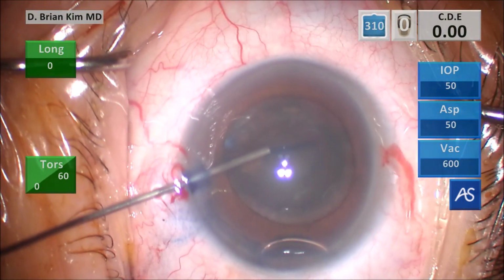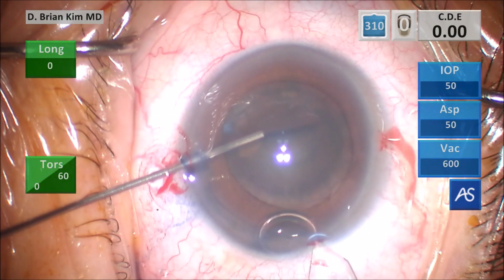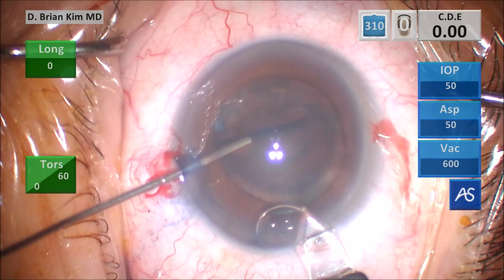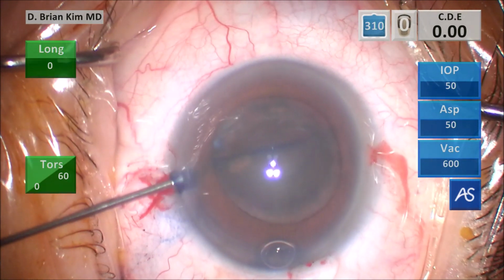And this is a triplanar corneal incision. I make a vertical groove, place the blade into the deep part of the groove, tunnel through the cornea, and then I dive down and enter. That's the triplanar corneal incision.